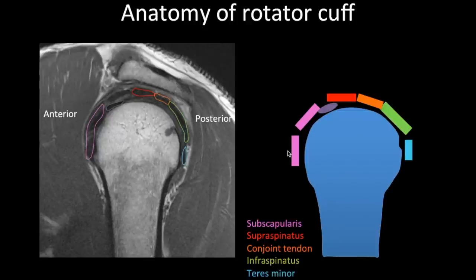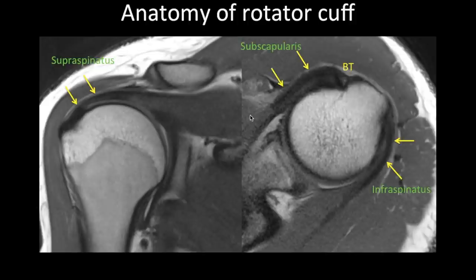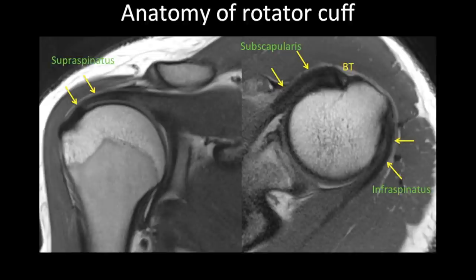Functionally the subscapularis consists of two parts: the superior and inferior subscapularis. On the sagittal image you can see all the rotator cuff tendons. On the coronal image the supraspinatus tendon is well visualized attaching to the greater tuberosity of the humerus, while on axial images you can see the subscapularis and infraspinatus tendons. Please have the patient's arm in the neutral or slightly externally rotated position. Do not scan with the arm internally rotated, as it makes it very difficult to assess the subscapularis and anterior supraspinatus tendons.